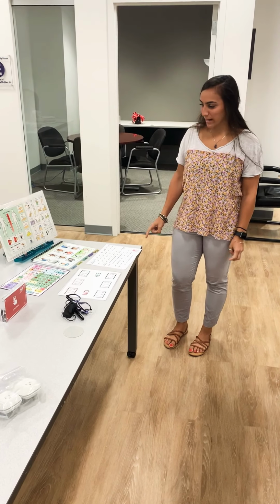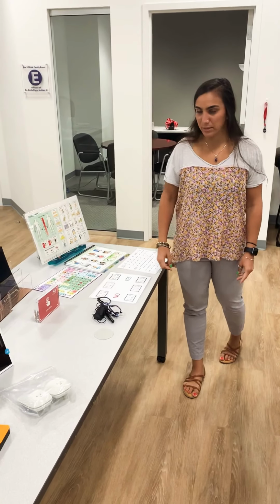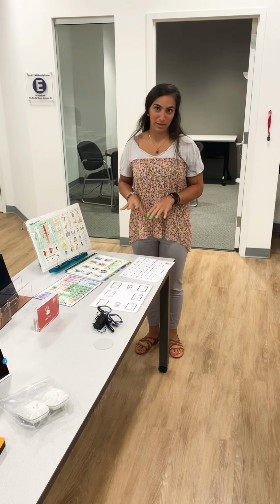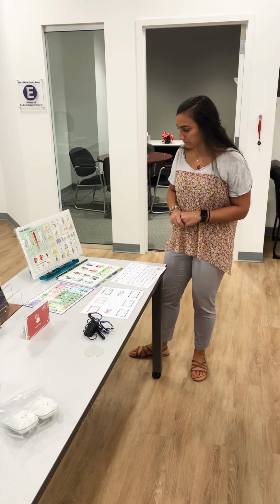Today we're going to review how to use different communication boards. This is a very low-tech way to help a patient with ALS communicate. We have a variety of communication boards here. This is not all the communication boards that are available. You can create your own, you can find them online.